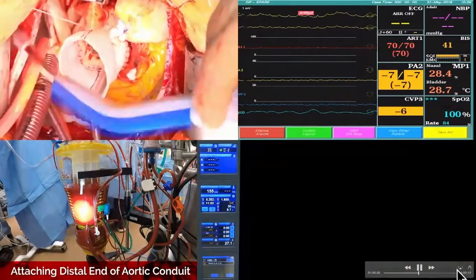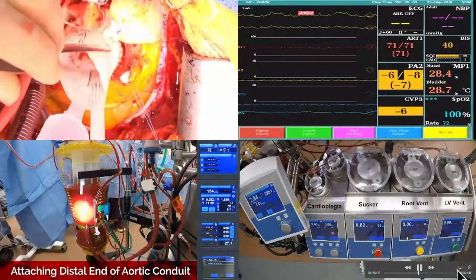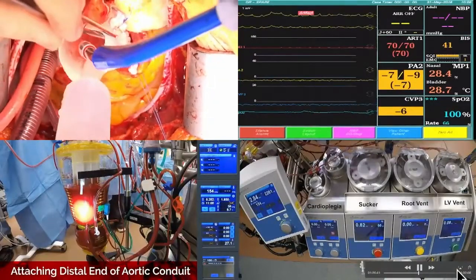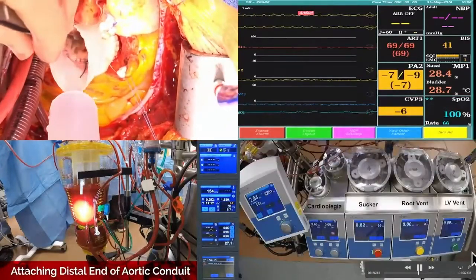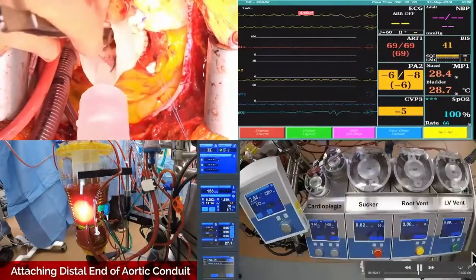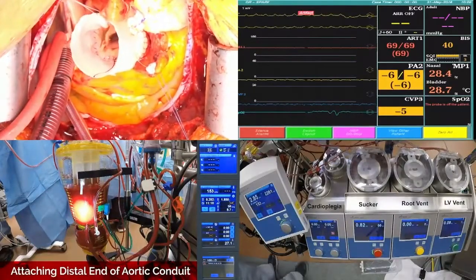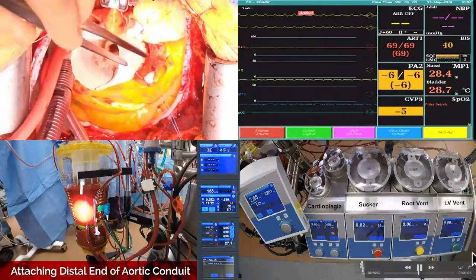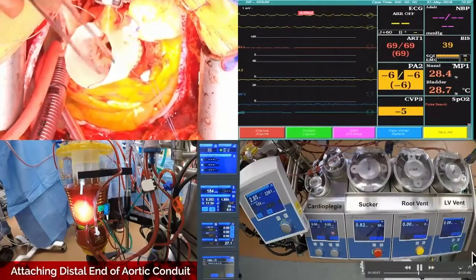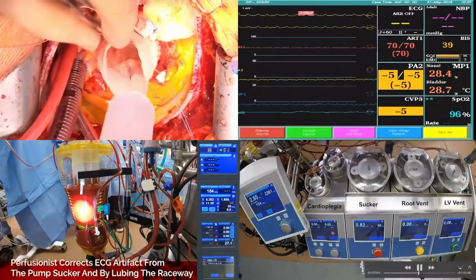No, see, you went back too far. Just like 10 seconds, 1 minute 17 seconds, or whatever it was. Lube is good. That's all. And hold on, we can move on if you like. No, I really want them to see this. This is classic. This is classic Mike Brown troubleshooting.